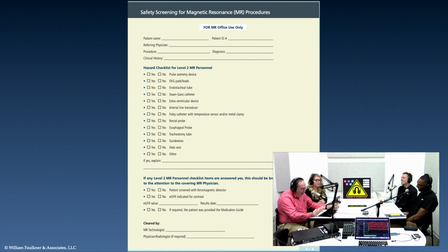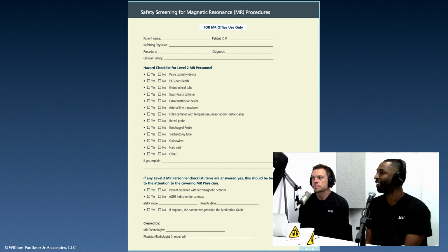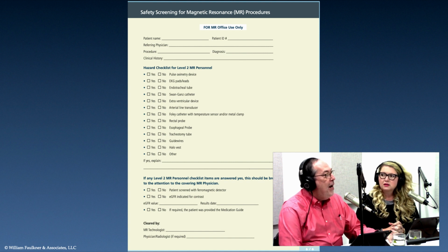I'm just going to say this is Bill's and my opinion. We have several opinions, as you can tell. You should also verbally ask the patient, is there anything on you or in you that you were not born with? That's part of the hard stop, the Zone 4 full stop final check. I think it should be asked earlier. Well, we do, but we also do it last. It's a really good question to ask somebody.